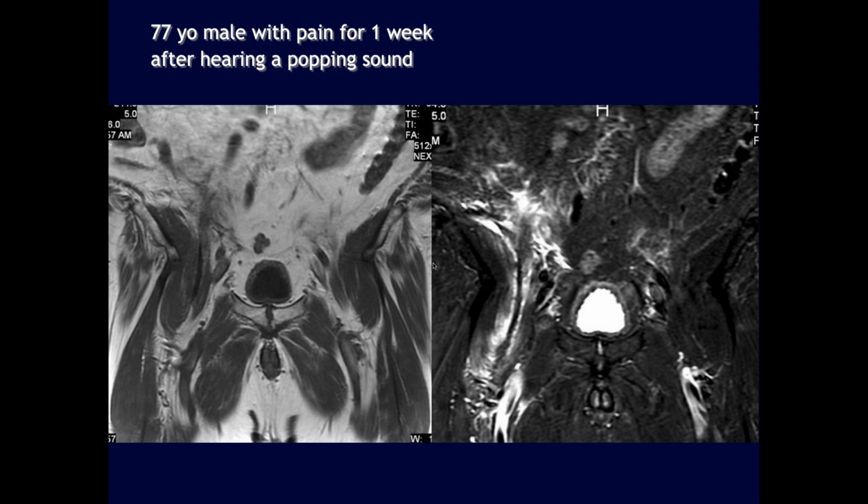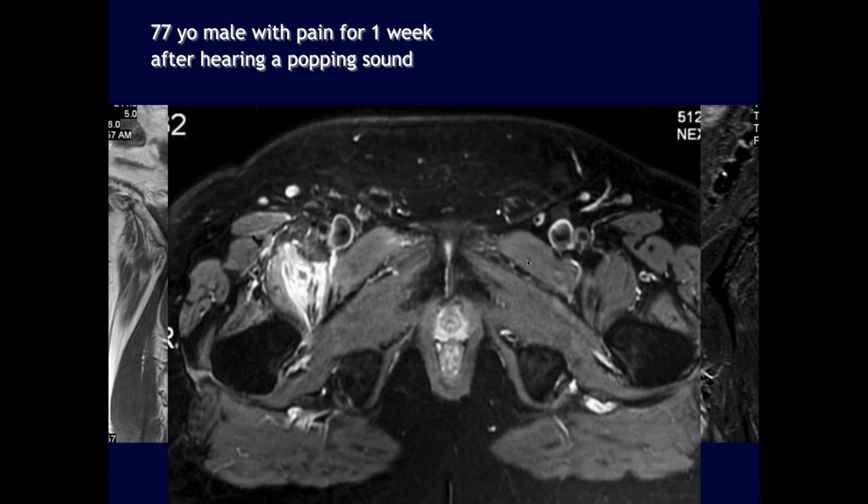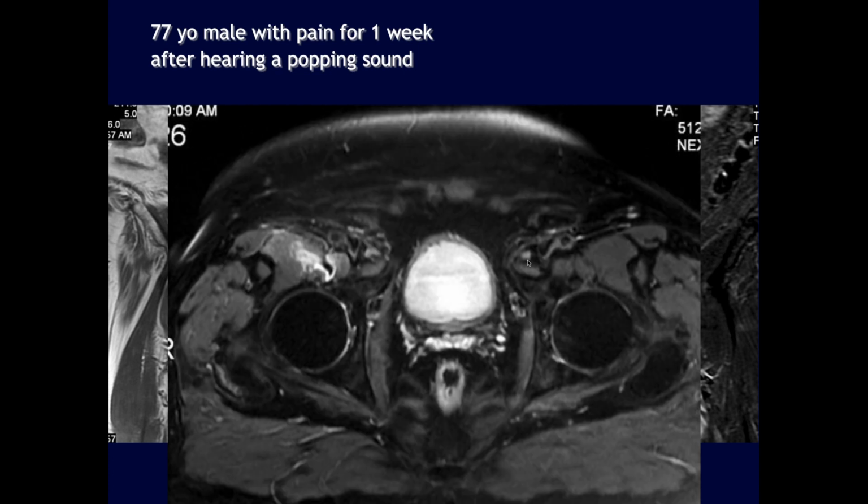Okay, 77-year-old male with pain for 1 week after hearing a popping sound. So there's quite a bit of edema along the myotendinous junction of the psoas, and it looks distally. I don't know if it's just the cut. It doesn't look like there's intact tendon. And here it looks like we have fluid where tendon should be. So it looks like a full thickness tear with distal retraction and strain involving the myotendinous junction as well.